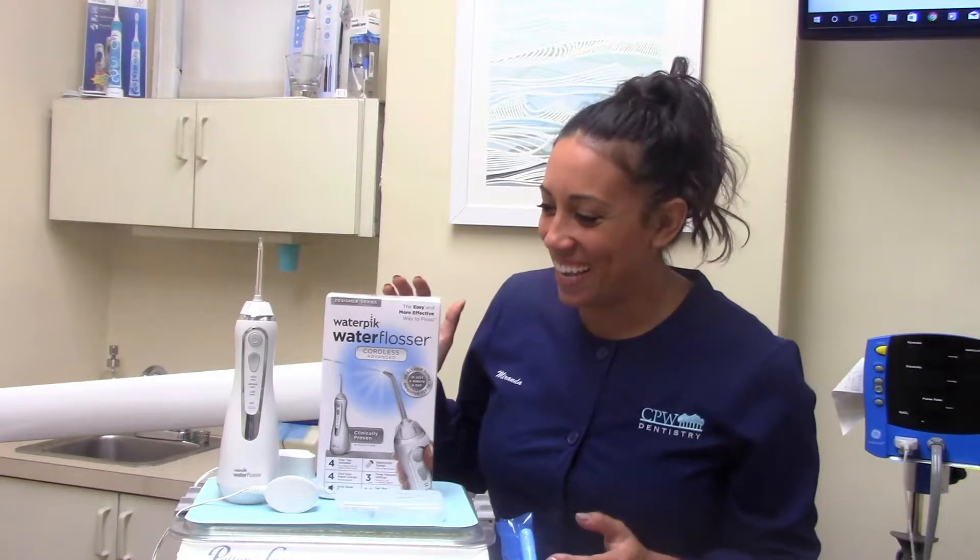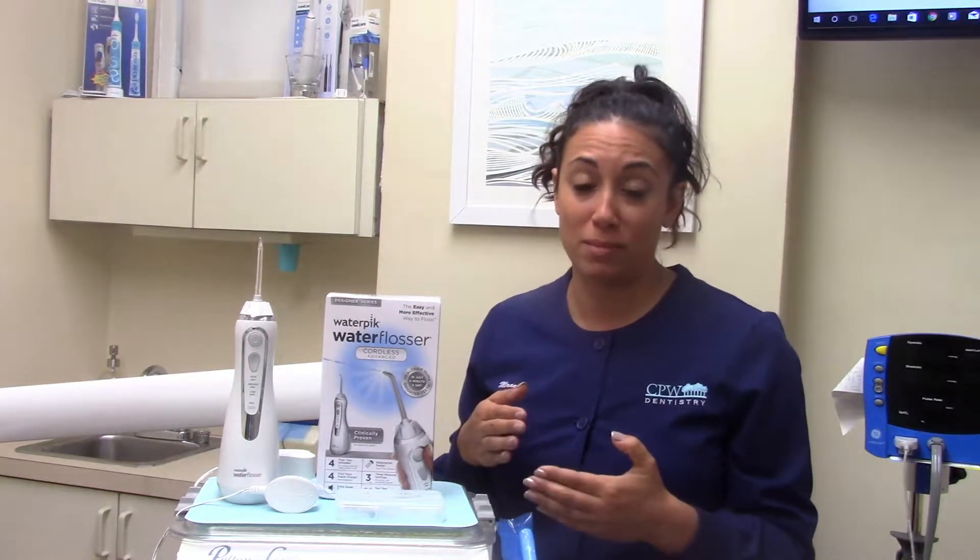The water flosser has three settings: high, medium, and low. I recommend starting at around a medium range. You can start off low, but definitely want to work your way up to high. High is a little intense in the beginning, especially if your gums have a little gingivitis going on and are very sensitive. Start at low or medium and then eventually build yourself up to high power, because the higher the setting, the more plaque is going to be removed.